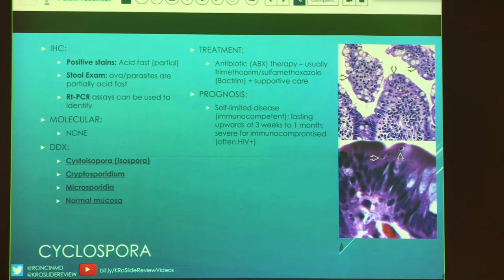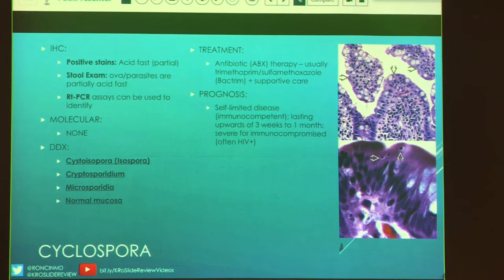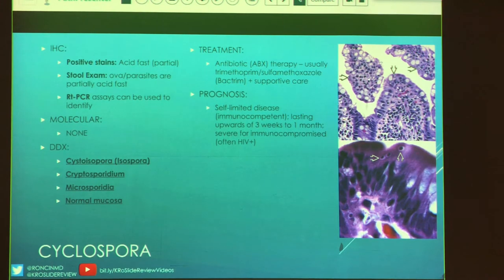The differential includes everything we've talked about plus normal mucosa. Treatment is antibiotic therapy — Bactrim in this case — plus supportive care given the heavy diarrhea and malabsorption. Usually self-limited in immunocompetent hosts over three weeks to a month. Can be severe and prolonged in immunocompromised hosts — consider HIV, chemotherapy, or transplant status. More examples of cyclospora on these slides.